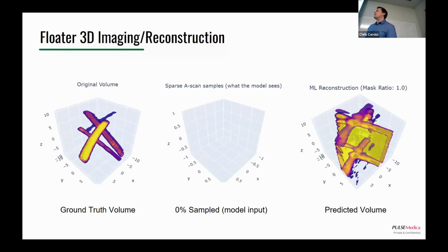And interestingly, we can actually completely sparsify or sample none of our OCT and just rely on the SLO. And you get kind of what you expect, kind of a Z projection of our shadow in our reconstructed OCT. This is really interesting for us because one of our products is actually going to be a screening device, a lower cost screening device for floaters.